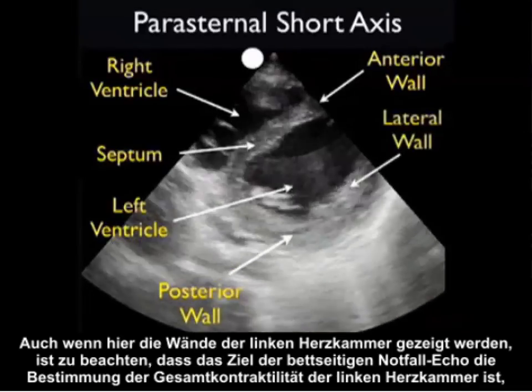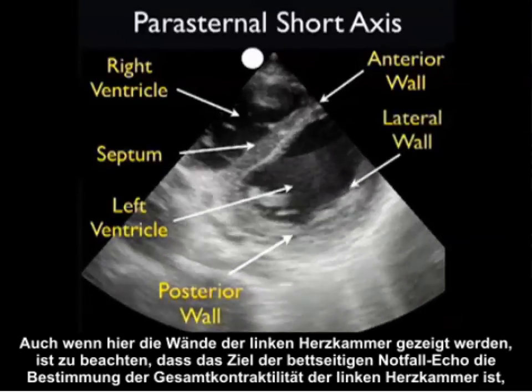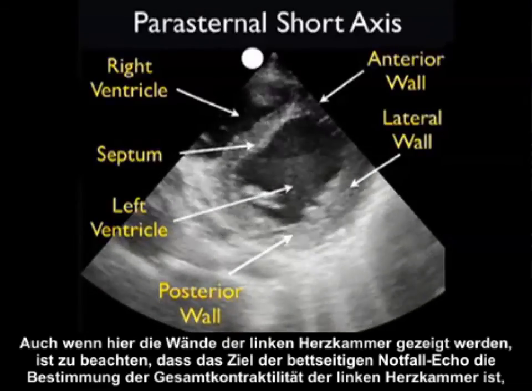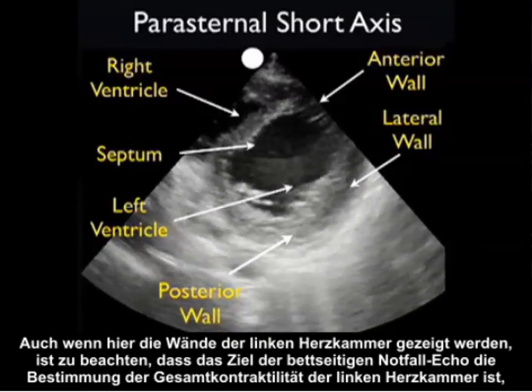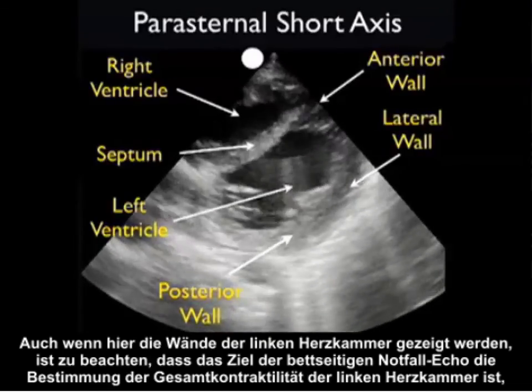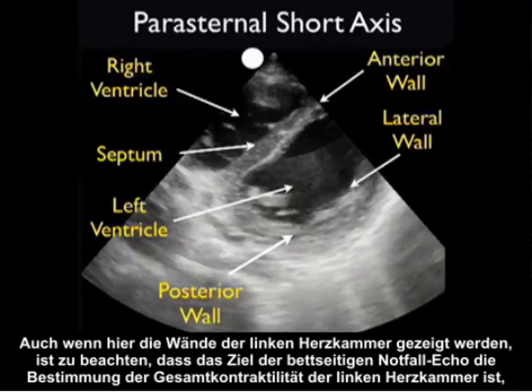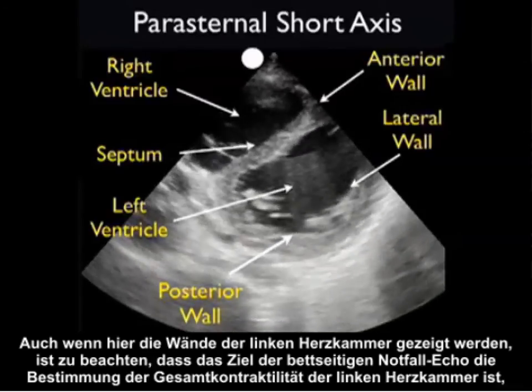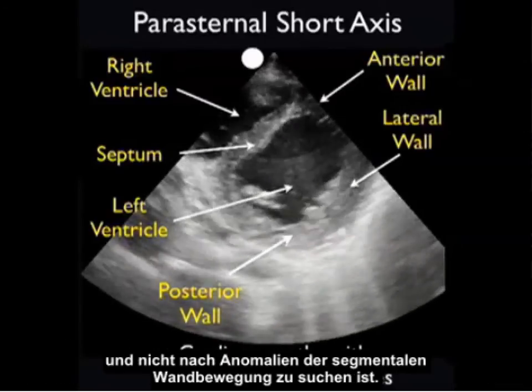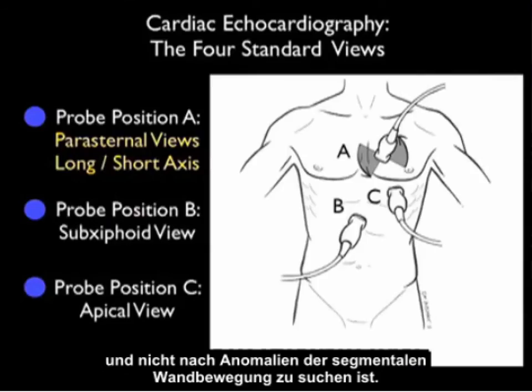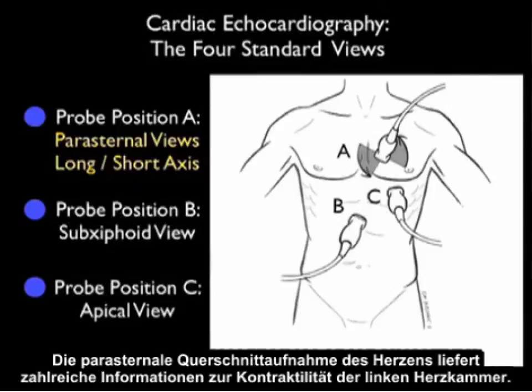While I show the walls of the left ventricle here, it's important to realize that the goal of emergency echo at the bedside is to determine overall left ventricular contractility rather than looking for segmental wall motion abnormalities. In conclusion, the parasternal short axis view of the heart gives a great deal of information about the contractility of the left ventricle.